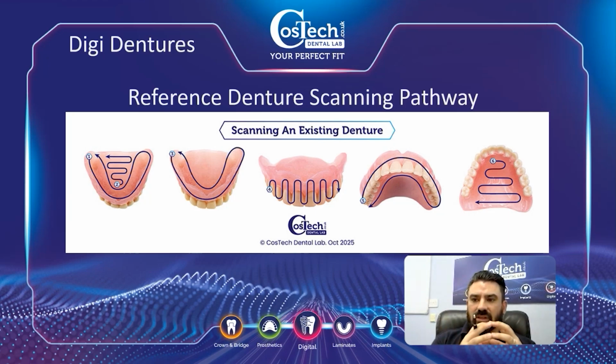If the denture is so worn out that you have to raise it up, you can use a little bit of ribbon wax. You can build up the wax. You just leave that on the denture when you scan it as well. It's exactly the same. The computer can pick it all up.